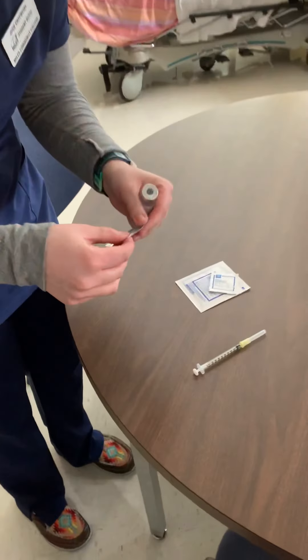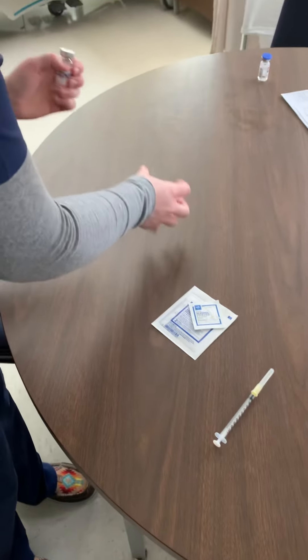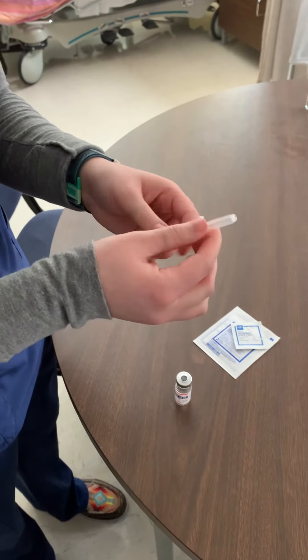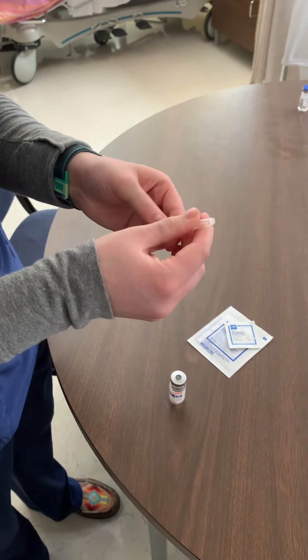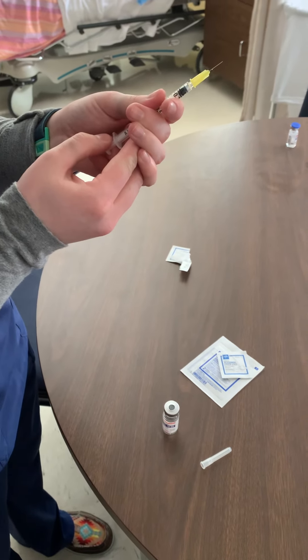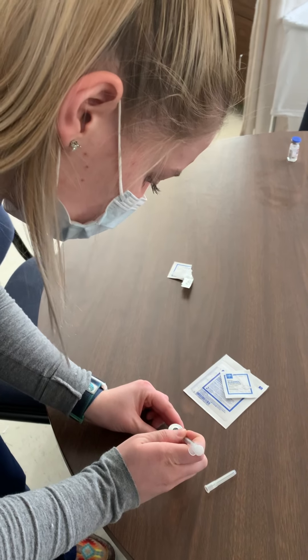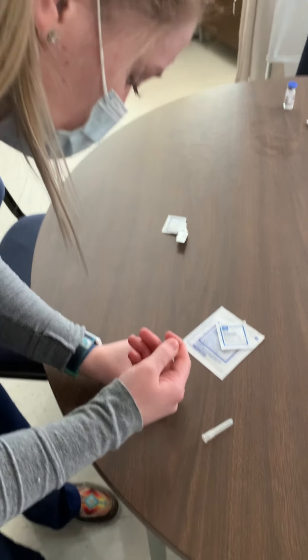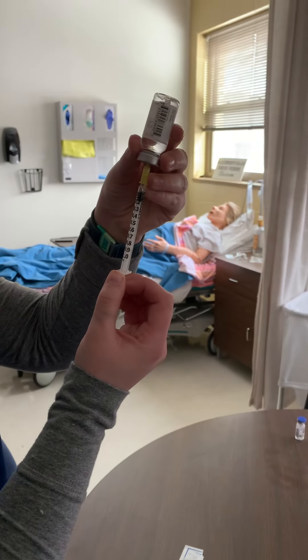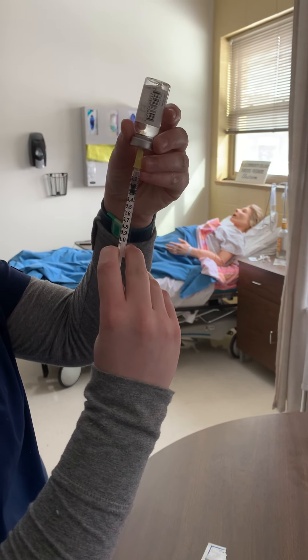I will clean the top of the vial with an alcohol swab and discard it. I'll uncap my needle, draw in enough air equal to the medication dose I'll be giving, insert the needle, inject the air, draw back the medication, and get out all the air bubbles.